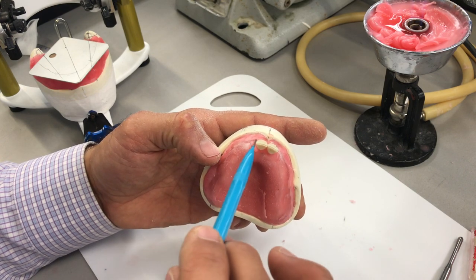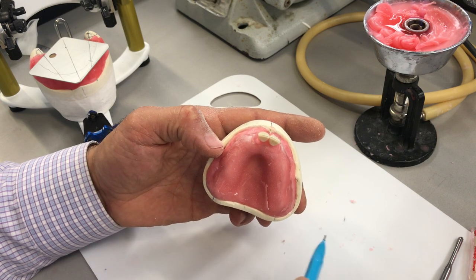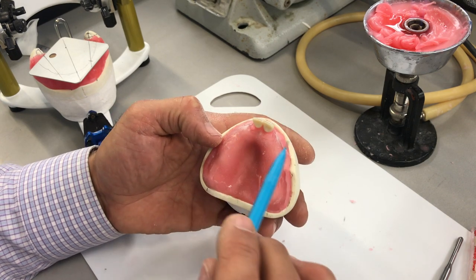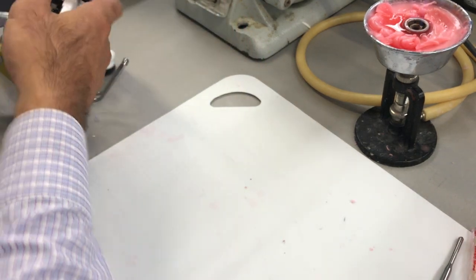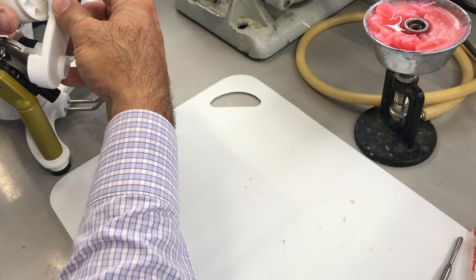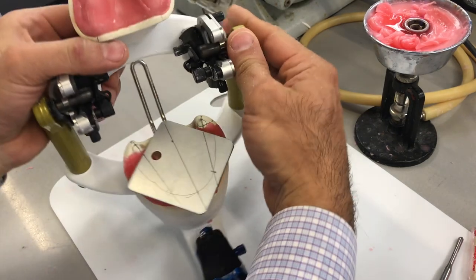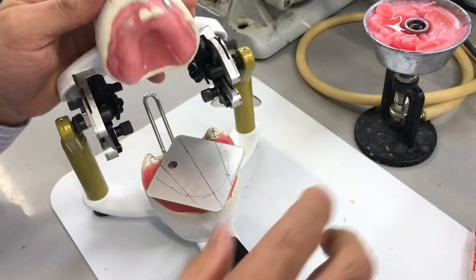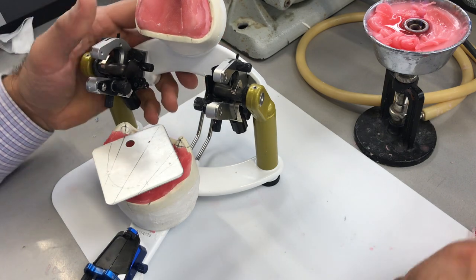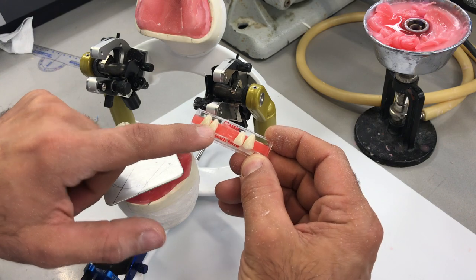Depending on the shape of the ridge, you have to start shaping toward that — whether it's tapered, square tapered, square, or ovoid. This ridge, as we talked about before, is more of a square tapered ridge. So from here on, I can move on to my laterals. I'm going to place my pin back into position. If you're right-handed, continue with the 2-2; if you're left-handed, go with the 1-2.